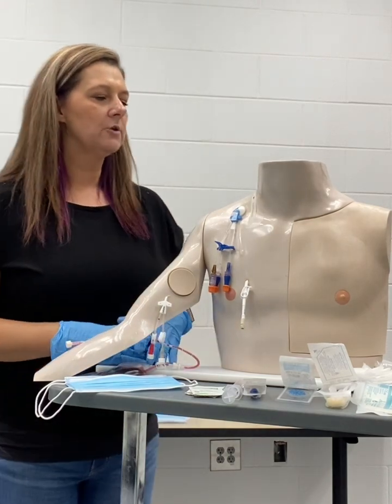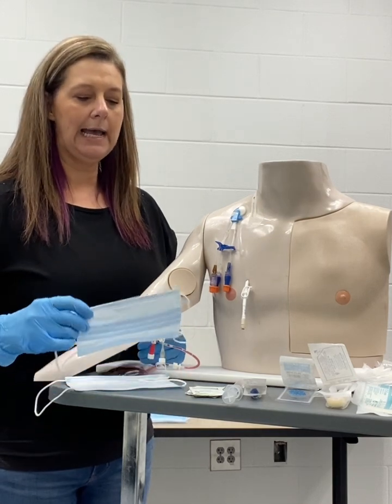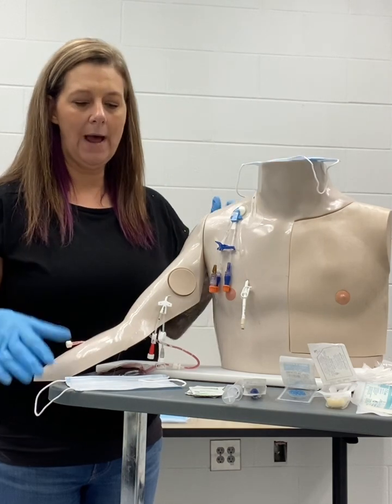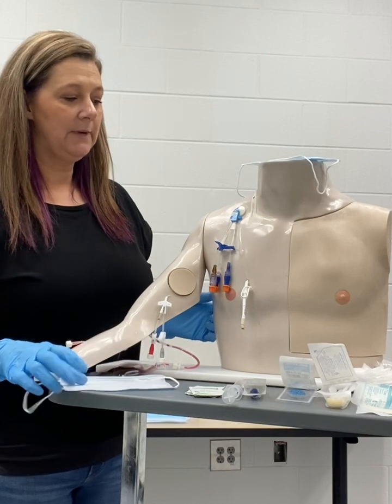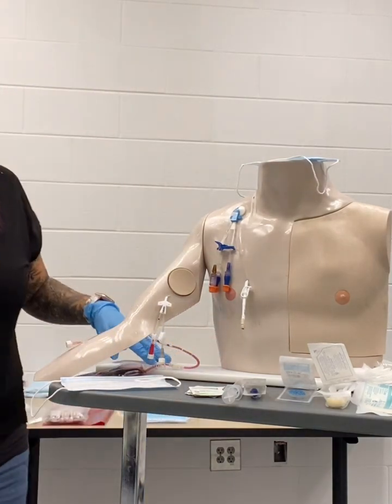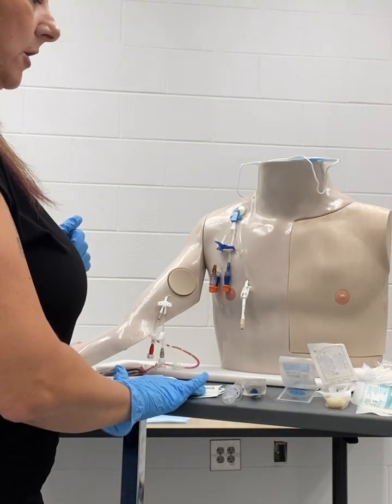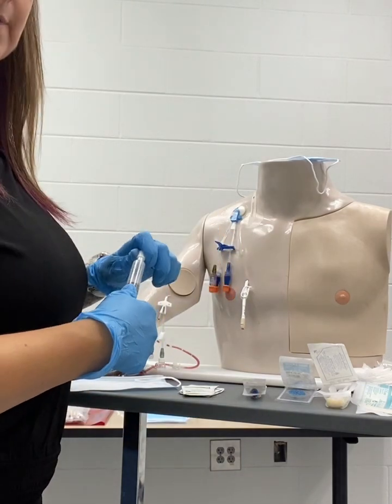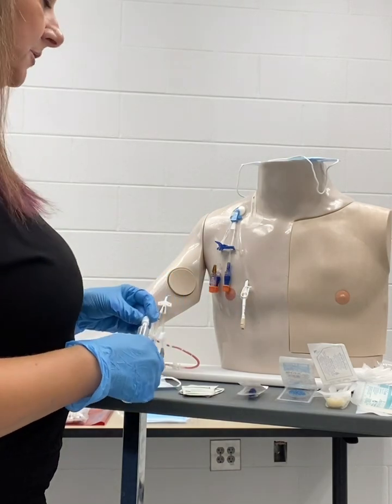For the central line dressing change, we will start with clean gloves. We always want to apply a mask to the patient, or have them turn their head away if they're unable to tolerate that, and we apply a mask to ourselves to keep this as sterile as possible during the change. You want to have your sterile supplies, your alcohol prep pads, your normal saline, three syringes, and three new caps to place on your central line during the procedure.